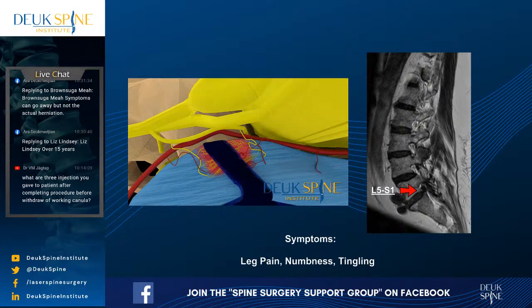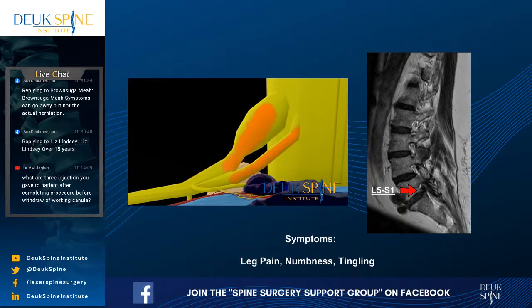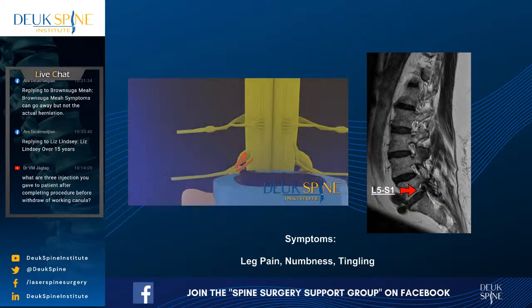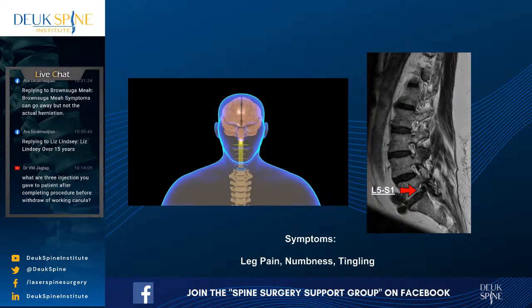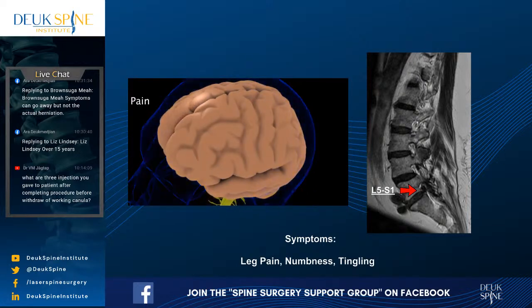And our patient comes to us from Indianapolis or Illinois, right? You guys are from Illinois? And she has a herniated disc at L5-S1 with back and left leg pain. And when you look at the MRI, you can see the herniation is in the foramen on the left side at L5-S1, and it's pushing on the nerve root very badly. So she's had horrible pain in her back and down her left leg.